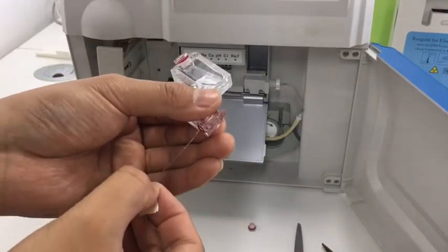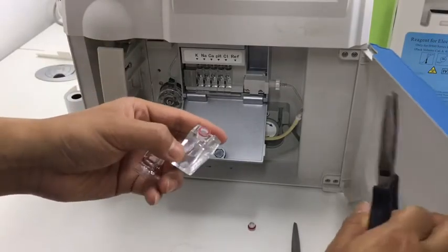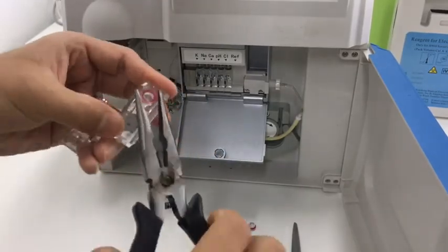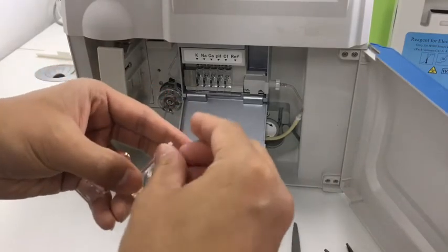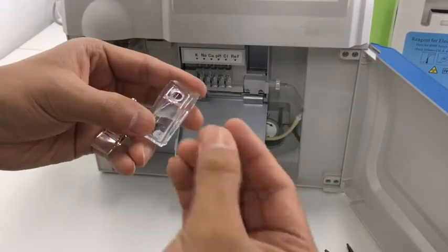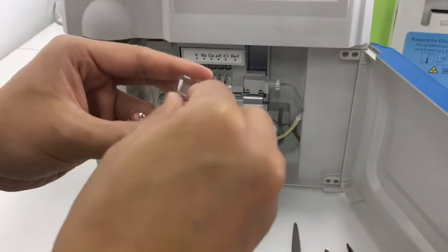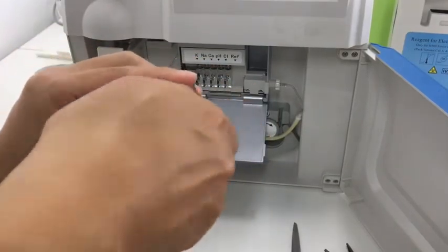Then remove the fishing line carefully. Then we use a clipper to remove the cap. The original cap has no hole, so we need to take it away and replace it with a new one that has a small hole. We then put it on the rough electrode.